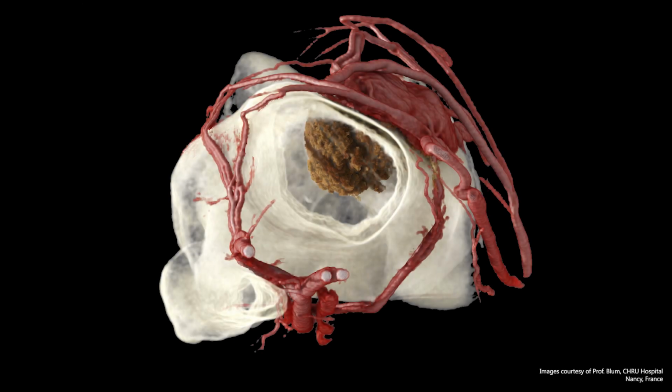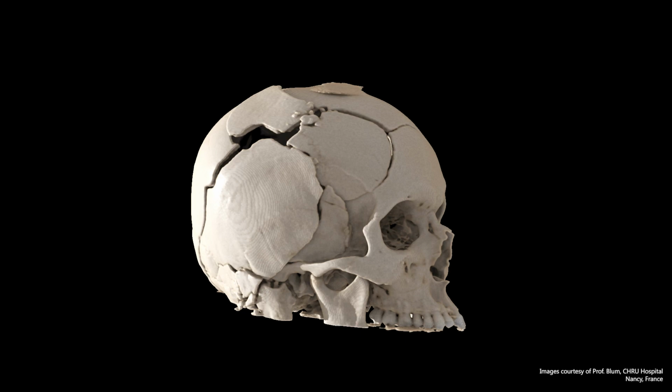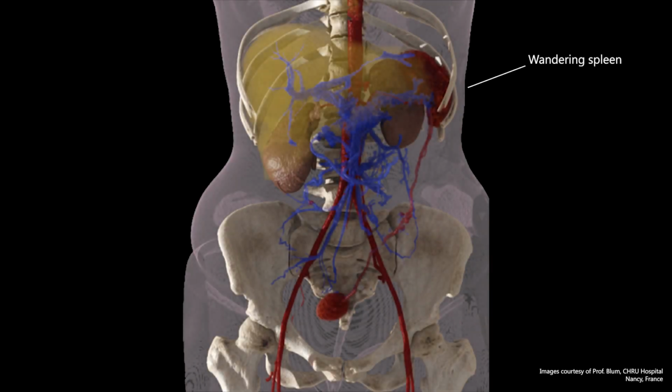It can be used with high resolution filter, which is clearly an advantage compared to VRT, which is usually based on standard algorithm images. So it will really improve the image quality for all the different applications that we have, not only bone and soft tissues, but also for vascular tissues. And so far we use it for forensic images, musculoskeletal trauma, and also for abdominal imaging.